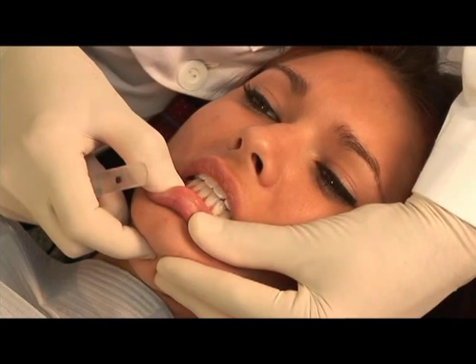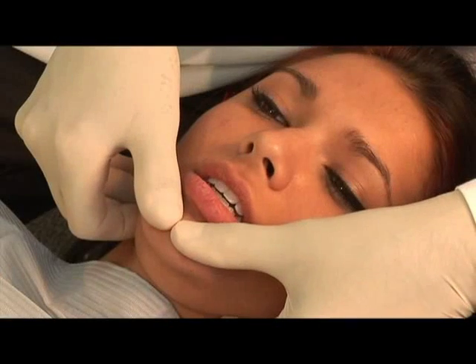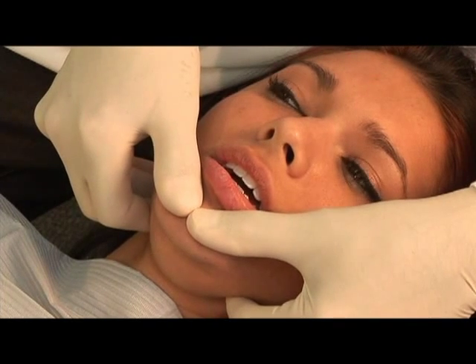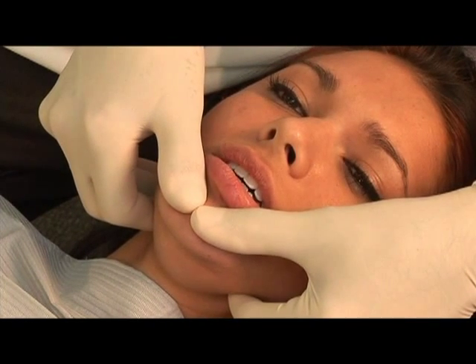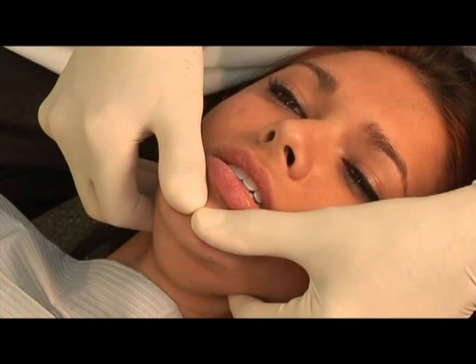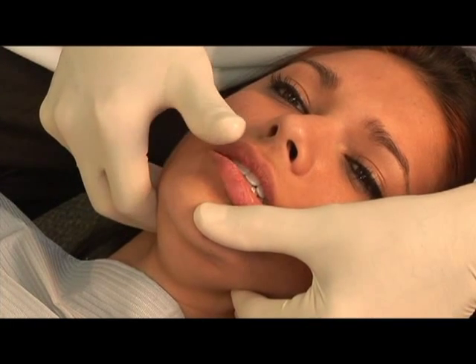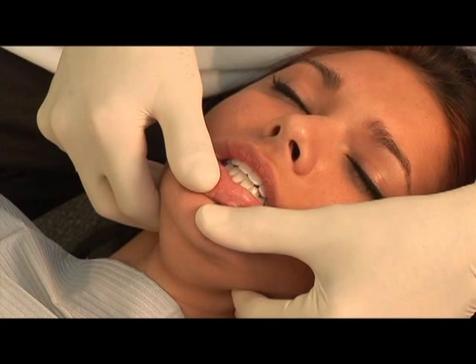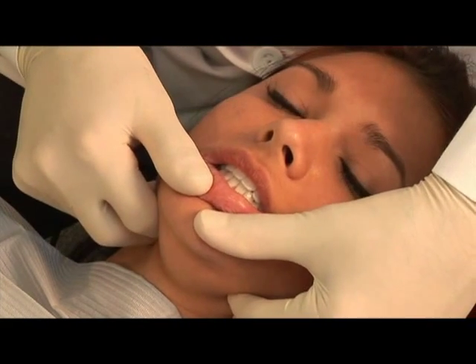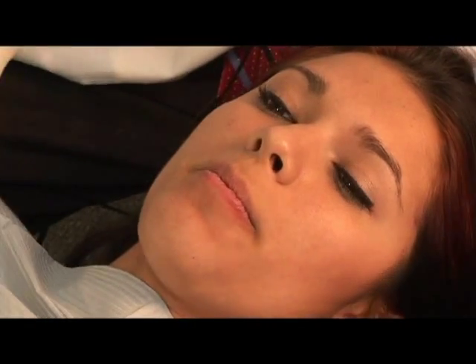Mm-hmm. Just hold right there. Open just slightly. Just let your jaw relax now. And just close to your first touch. Feel it touching right there. Hold there. And close on down. Okay, so you have a little bit of a slide there. All right, relax your jaw.